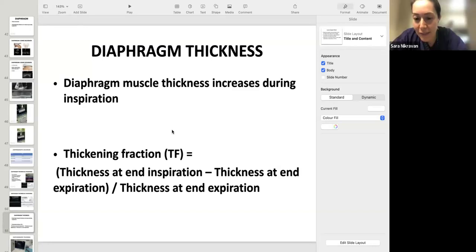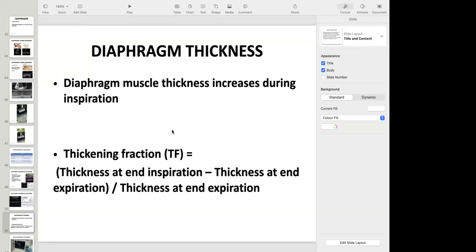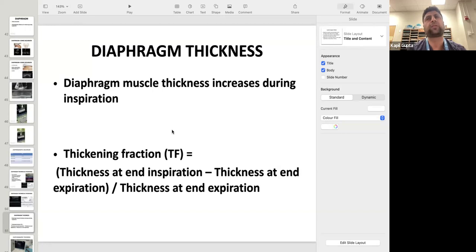Samuel, I'm sorry, I think you may have unmuted yourself. Was that the question that you were hoping to ask? Yeah, my question is, thank you for this talk. I wanted to know how many B lines can we see on a single view for a normal lung, and how many of them do we say this one is considered a normal lung?